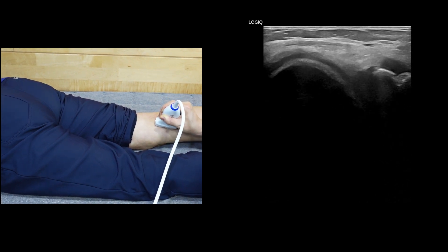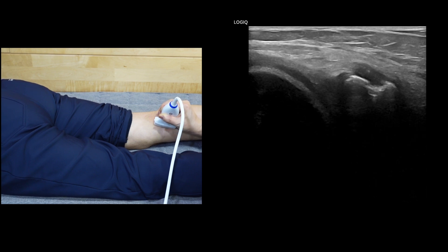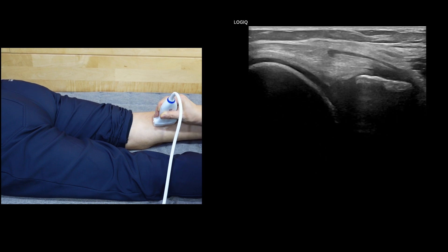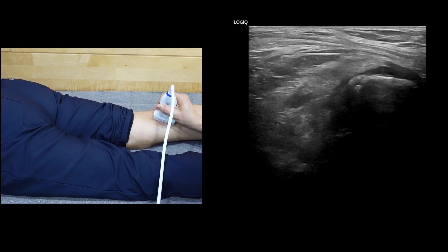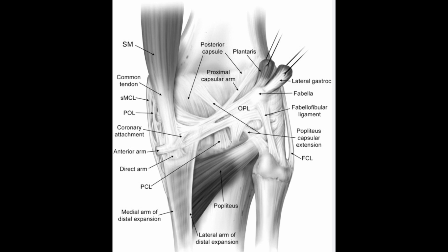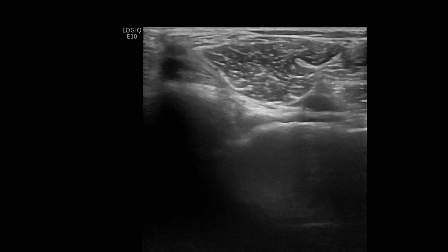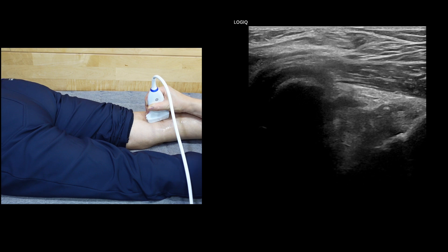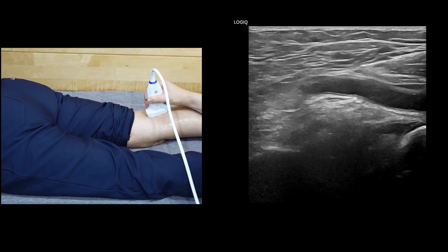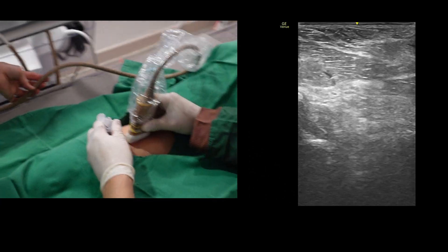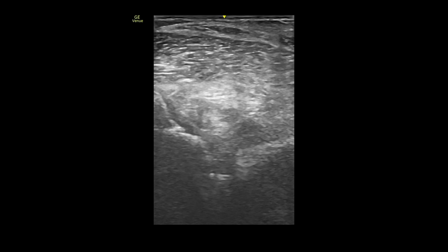Next, focus on the semimembranosus tendon and the adjacent bursal space. When scanning the posterior medial knee in transverse planes, you can identify the sartorius, gracilis tendon, and semitendinosus tendon behind the semimembranosus tendon. The semimembranosus-gastrocnemius bursa is visualized using axial planes positioned between the semimembranosus tendon medially and the medial head of the gastrocnemius laterally. Also, look for the presence of a Baker's cyst. In the popliteal fossa, sweep the transducer up and down to demonstrate the popliteal neurovascular bundle, including the popliteal artery, vein, and tibial nerve. This tracing is particularly important during ultrasound-guided injections in the posterior fossa, mainly targeting the posterior fat pad. If you are unfamiliar with posterior injection, please watch the adult knee series.